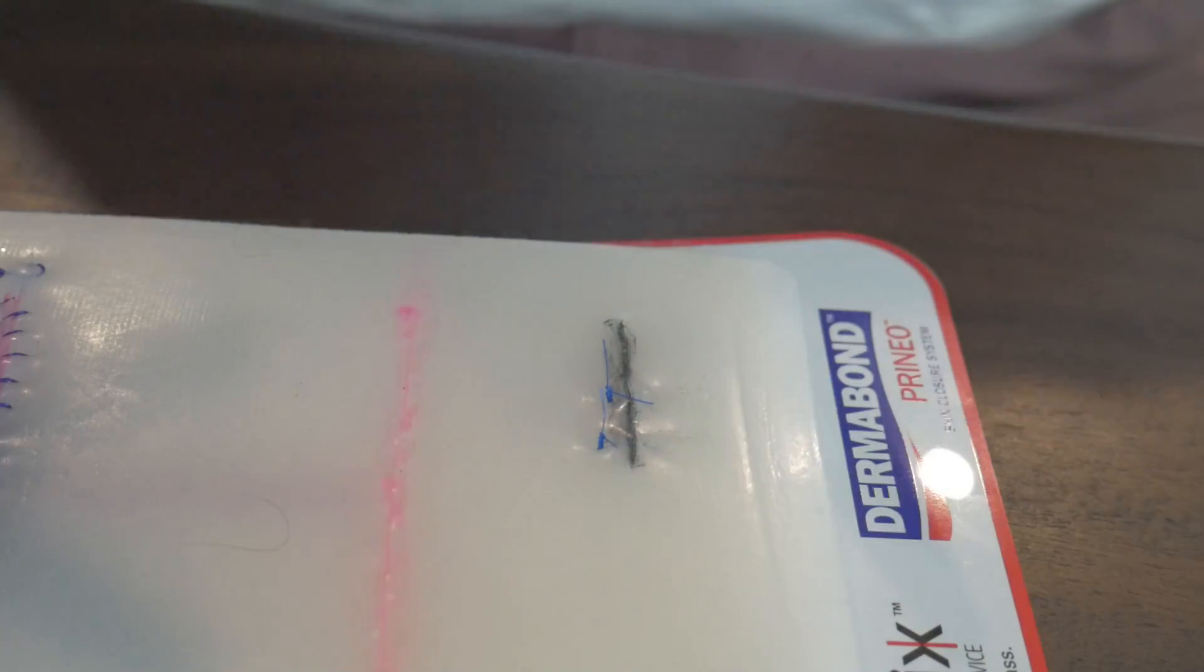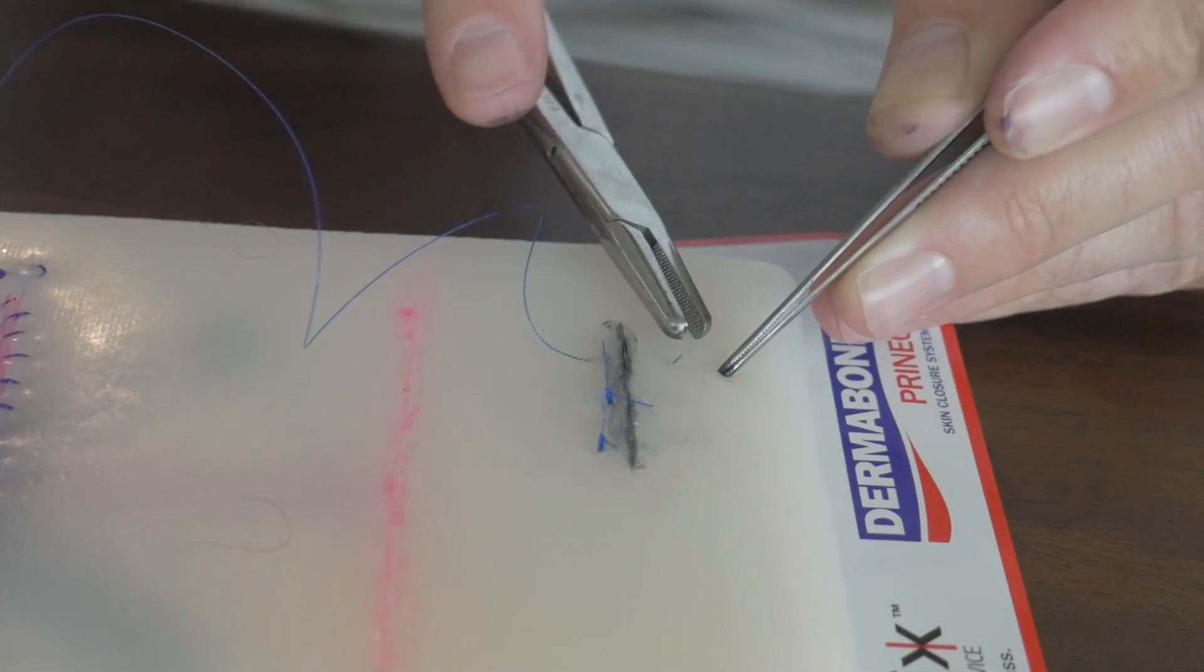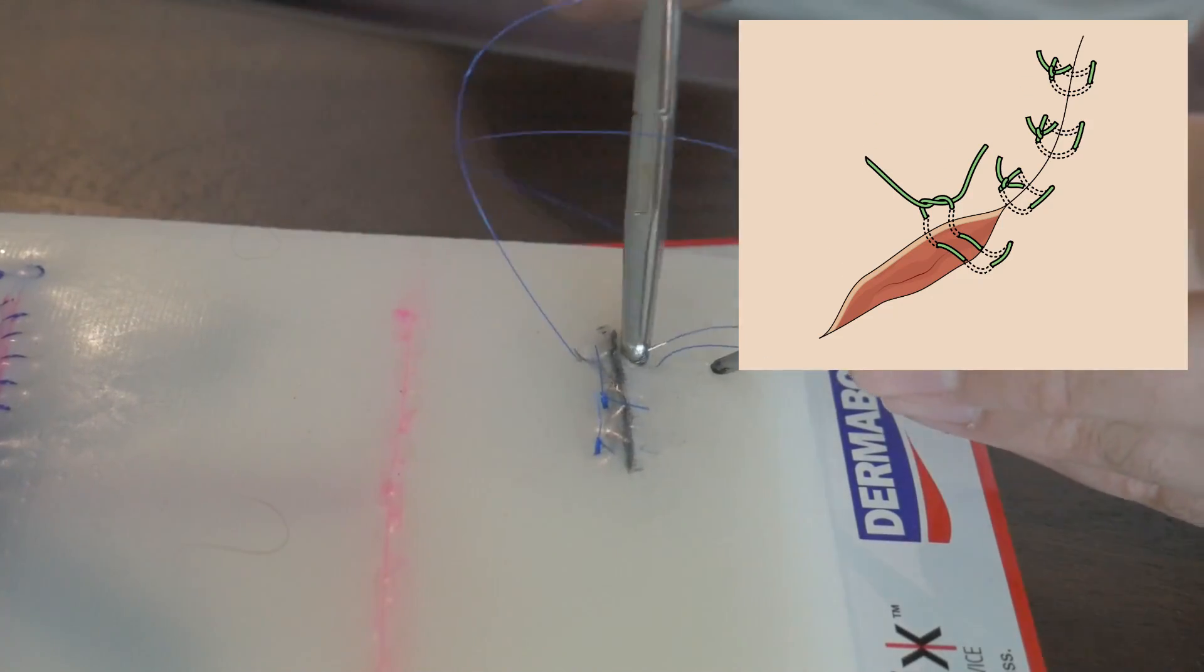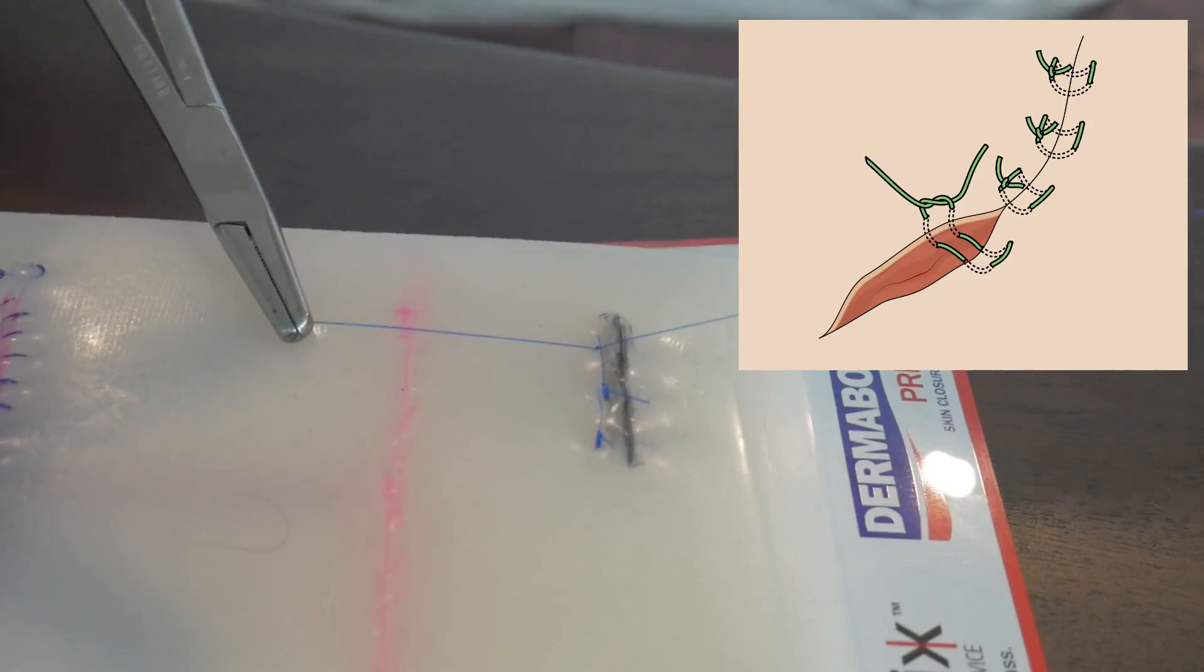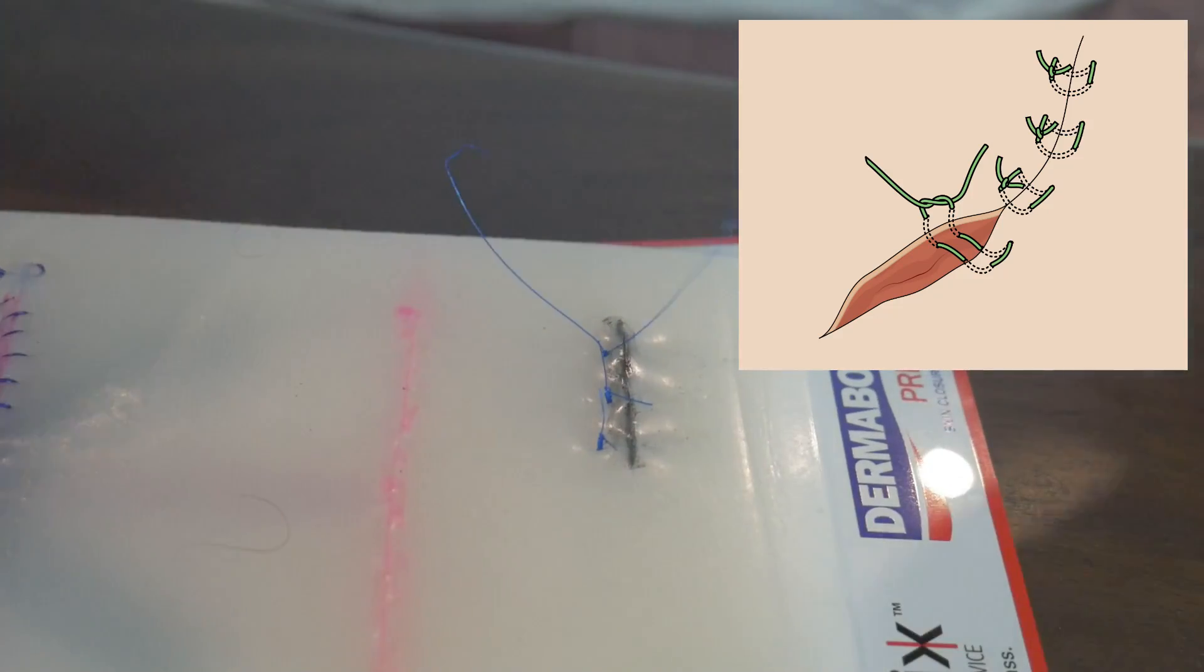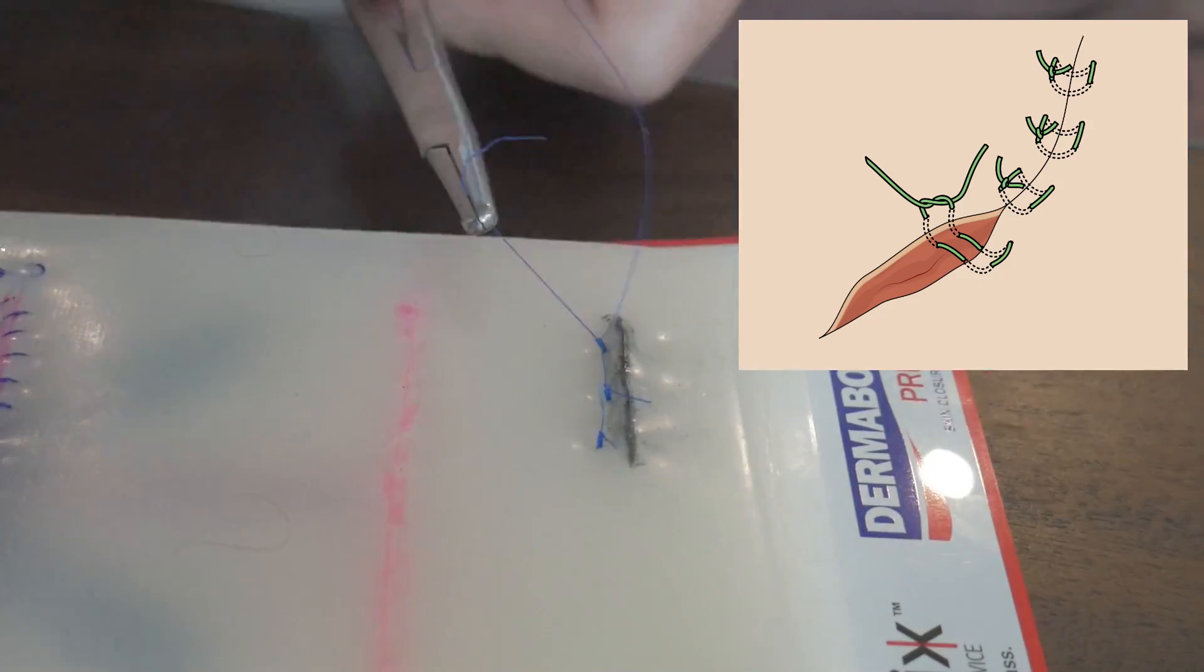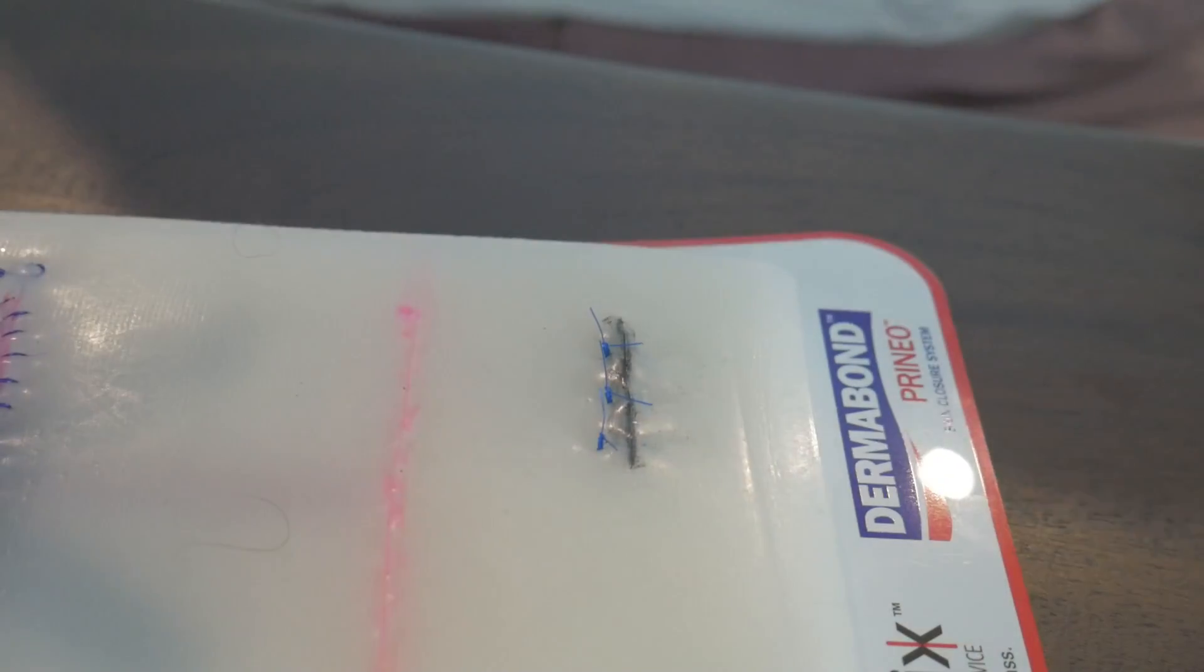Now there is also a second variant of this called the horizontal mattress stitch. I'll put a picture of the horizontal mattress stitch up here in the upper right. I just don't have time to do all of these. It would be a super long video. It already is a super long video. But yeah, so that's a horizontal mattress, very similar, but you're just going in and out on one side and in and out on one side, versus this, the vertical mattress.